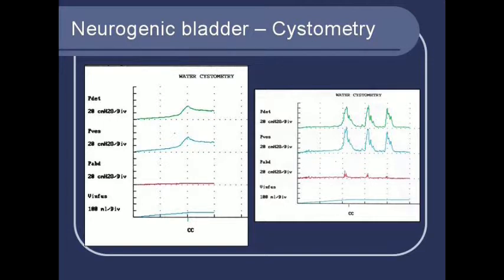So that has happened because perhaps his bladder is not being inhibited by his brain, and therefore he is voiding at very frequent intervals. I don't know what the proper treatment for this would be, perhaps training will help him, but it is interesting to see that this pattern can change. He came after a few years with a typical hypocompliant bladder, so situations might change.